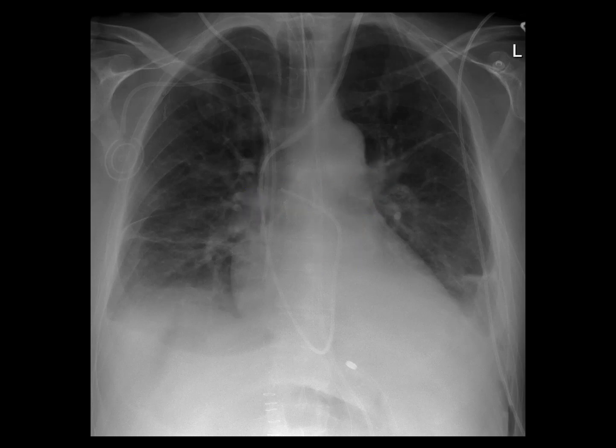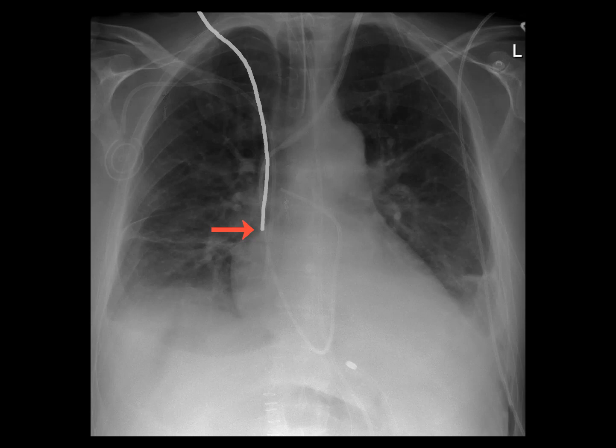This patient has three separate central venous catheters, including a subclavian portacath with tip in the right atrium, a non-tunneled right IJ central venous catheter with tip at the right atrial superior vena cava junction, and a Swan-Ganz catheter passing through the left internal jugular vein through a sheath.